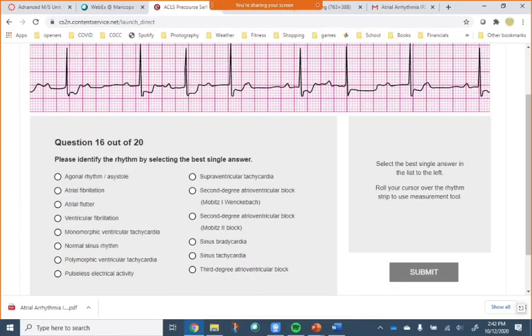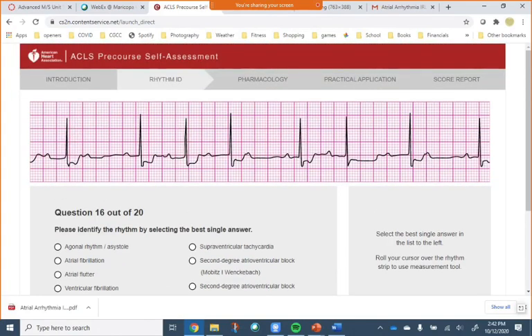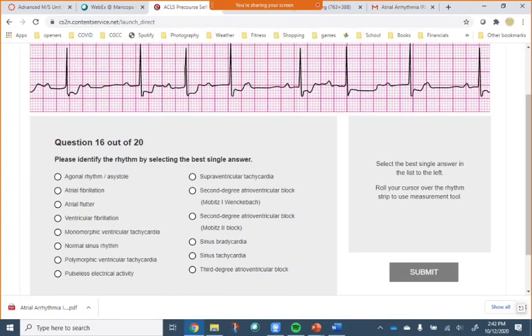I think I will probably call this a 1st degree along with you, and then we'll see what we've got going on. But you're right, it's not really a fibrillation. It's definitely, it's not a Brady. I'm wondering if they want to call that PACs. Let's call this 1st degree and see what you guys got. This one's tricking me out too. But 1st degree is not on here. It doesn't want to call it 1st degree.